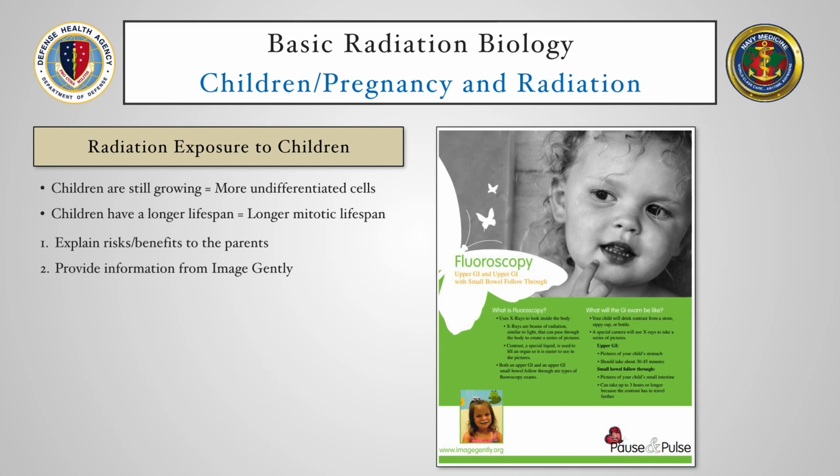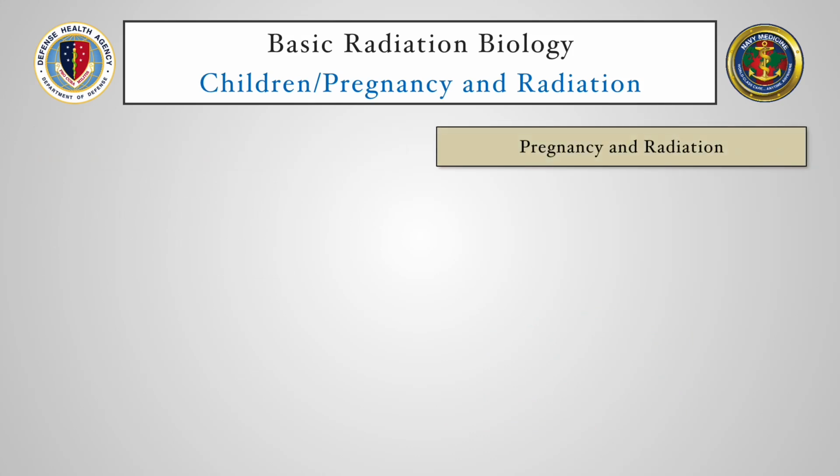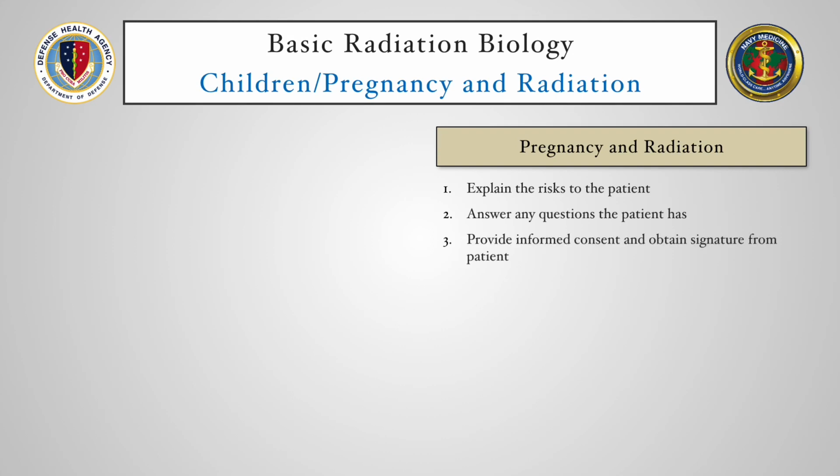The decision to perform a radiologic procedure on a patient who may be pregnant is a medical decision and shall be made by a physician in consultation with the patient. If the procedure is to be performed, the physician must explain the risks to the patient and provide informed consent. So you explain the risks to the patient, answer any questions the patient has, and obtain a signature from the patient.